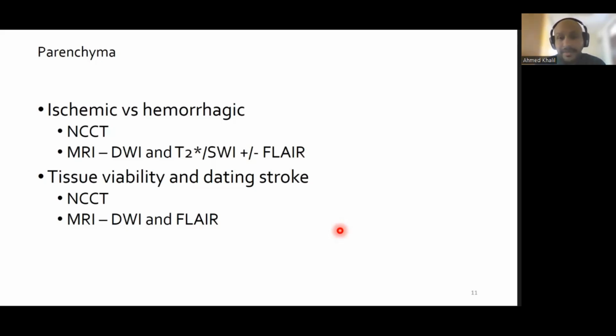Some patients cannot tell you that because they have a very severe speech problem, for example, or because they have dementia and they don't remember, or because they were asleep when it happened. There are many different reasons. In those kinds of patients, being able to tell based on just imaging parameters, just looking at the images, how old or fresh the stroke is, is really crucial to guiding the treatment of these patients.